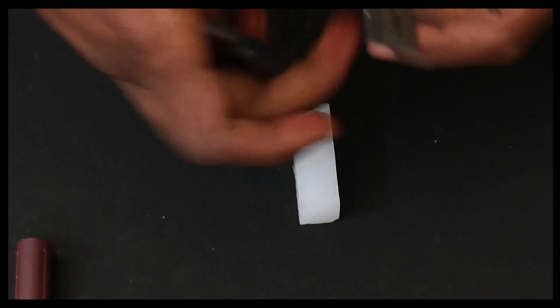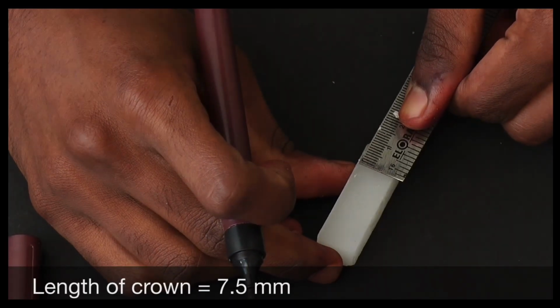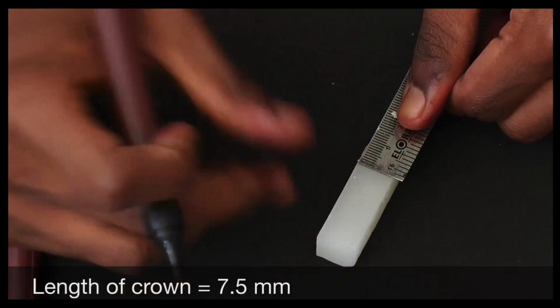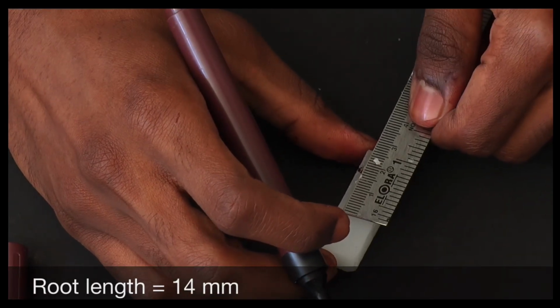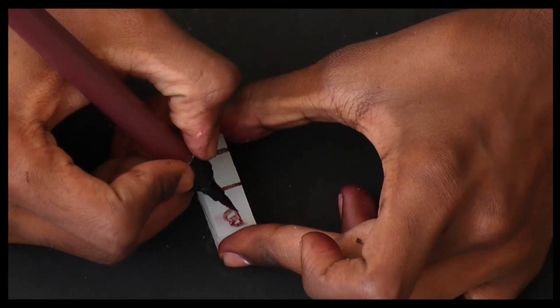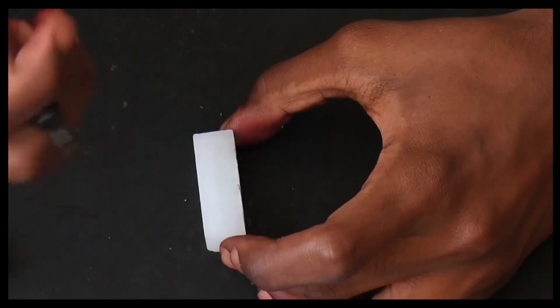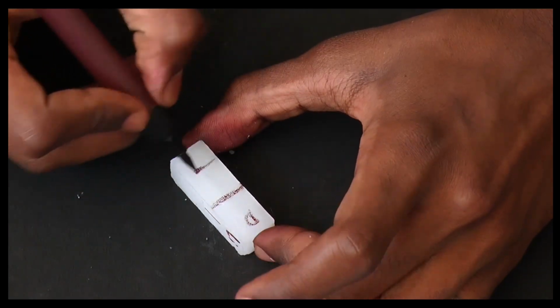Here go the markings. Length of the crown is 7.5 mm. Length of the root is 14 mm. Okay, this is our distal side. Let me just extend my markings.